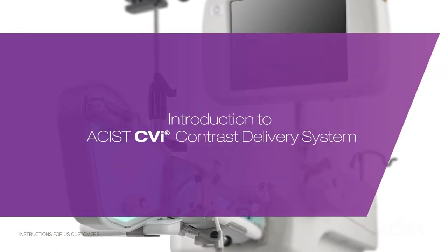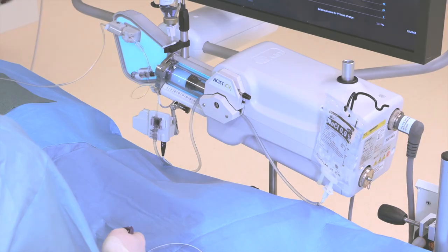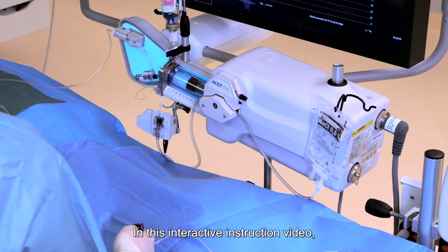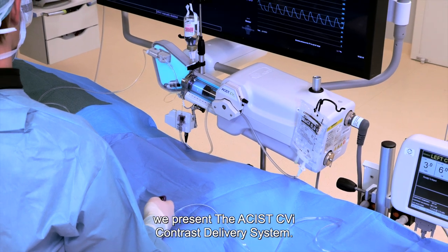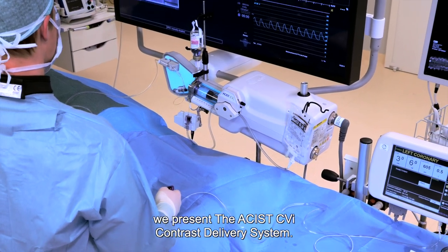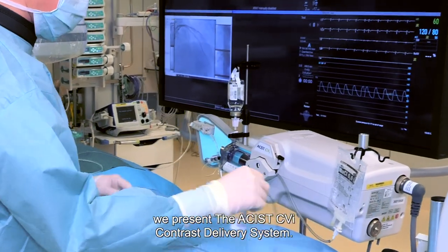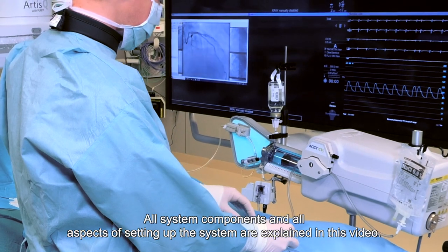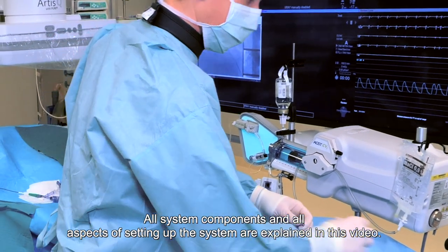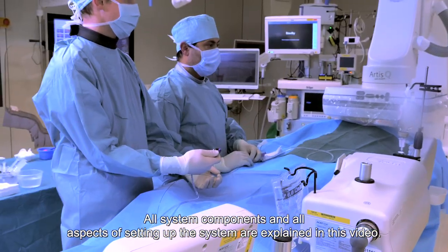Introduction to the CVI Contrast Delivery System. In this interactive instruction video, we present the ASSIST CVI Contrast Delivery System. All system components and all aspects of setting up the system are explained in this video.